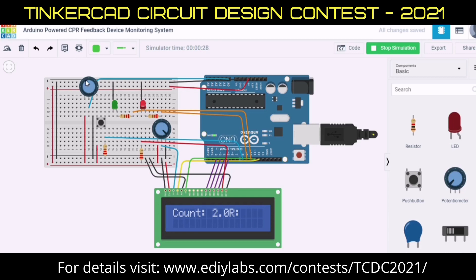When you push hard enough to the correct depth, it will automatically indicate by turning green. That's why you have to understand how much pressure and depth we have to give to the patient.